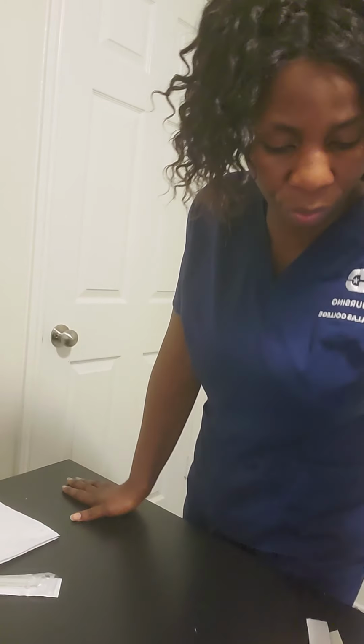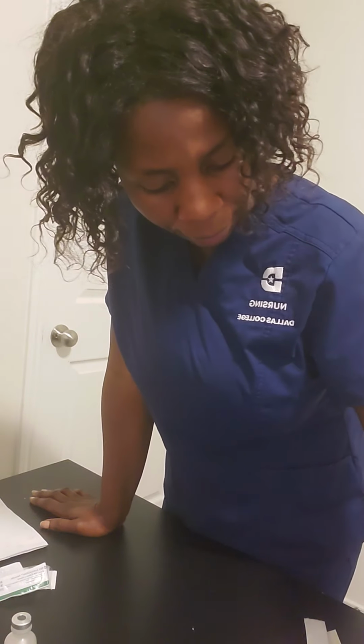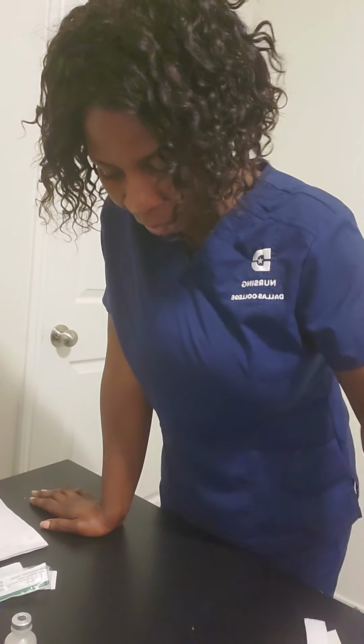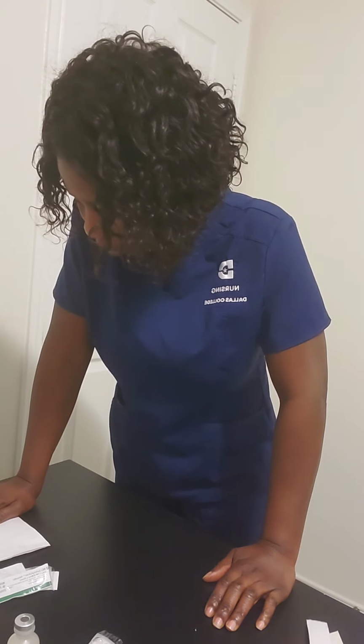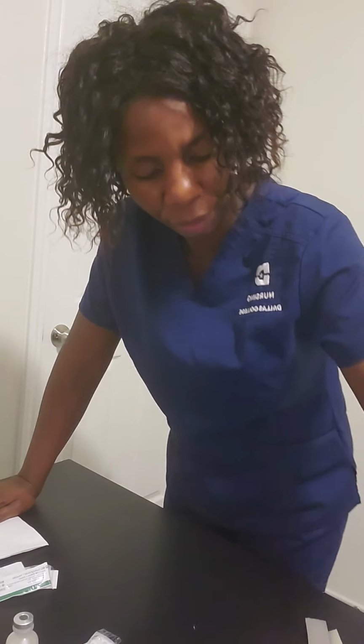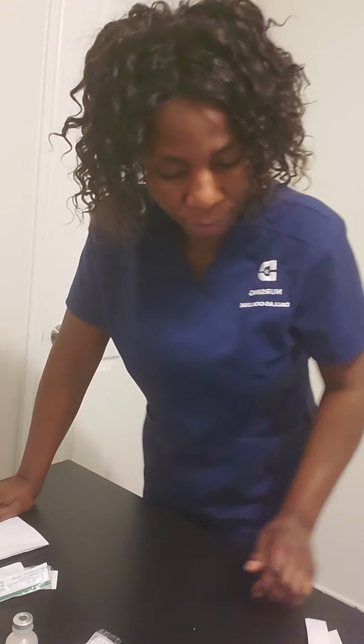To administer this, I'm going to need syringe and needle. I'll be using 3 ml syringe, and I'll need to use 2 needles, which I'm going to set aside. Then for the PPD, for the sake of this video, I'm going to pretend this is a PPD. I don't have a PPD. I'll use my bacteriostatic water for my PPD, and I'm going to use a tuberculin syringe to administer the PPD. For the next medication, I have NPH insulin. I'm going to bring that out from the drawer, NPH insulin. Then I have sliding scale regular insulin from the drawer. I'll bring that out. Then I'm going to administer that with insulin syringe.